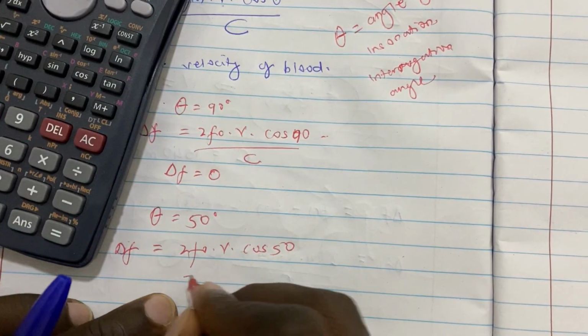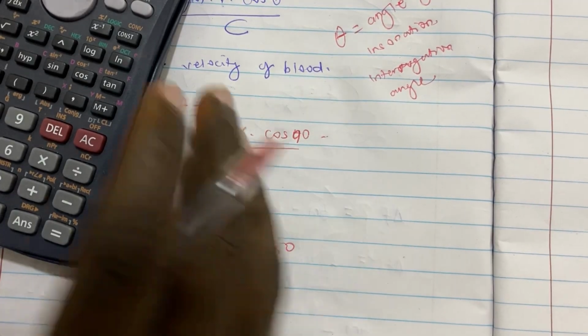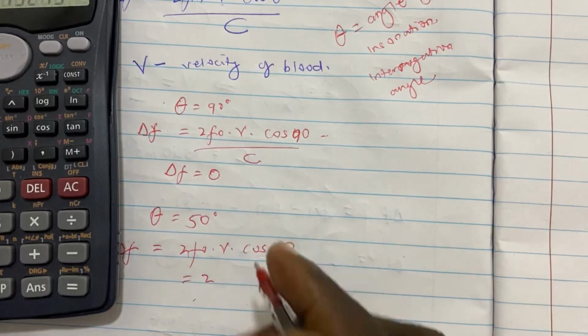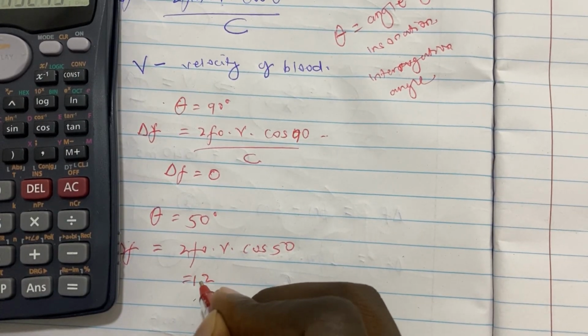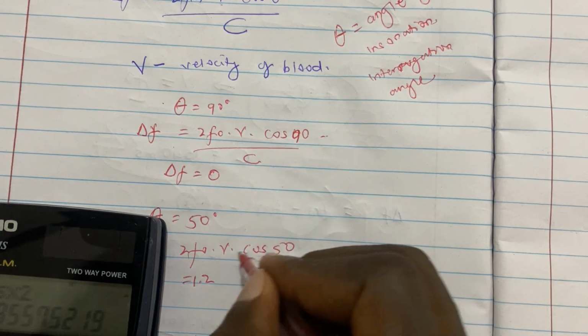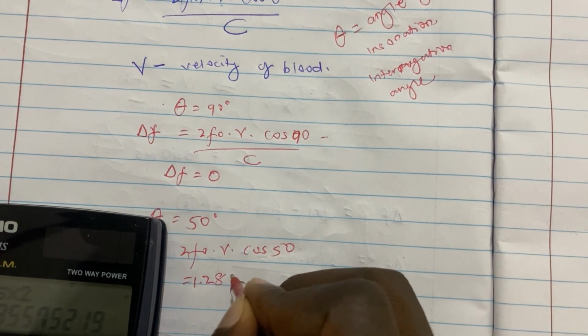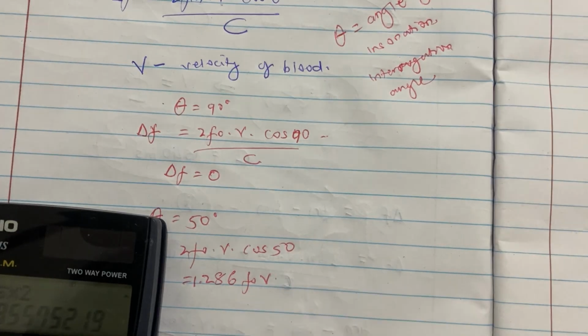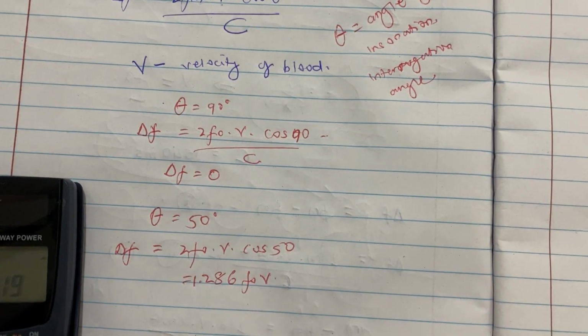So it will be 1.2856 f naught V. That will be the Doppler shift.